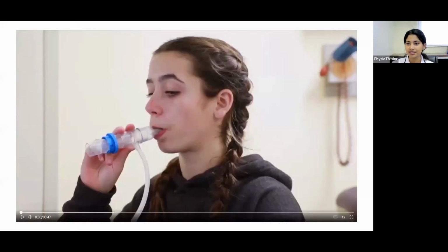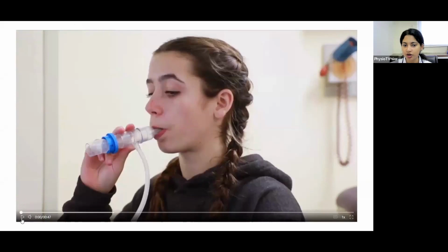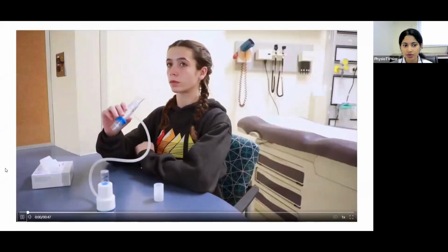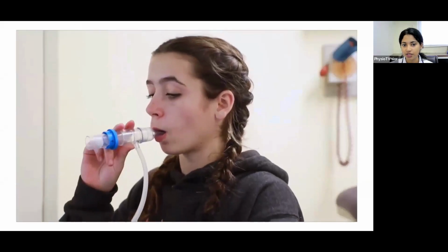All right. So let's have a look at a video showing a low PEP therapy being used with a mouthpiece. So as you can see, she has held a mouthpiece.